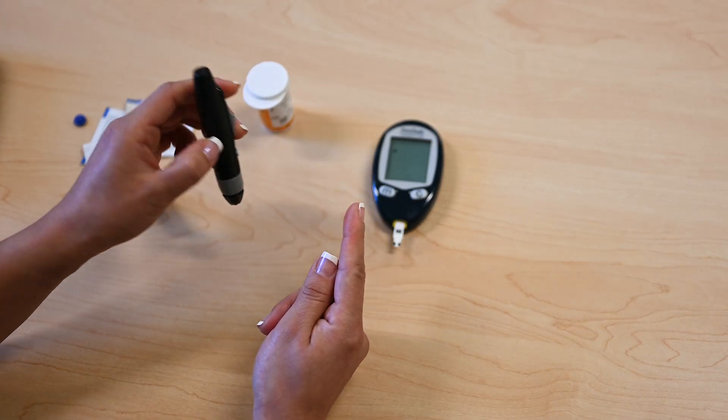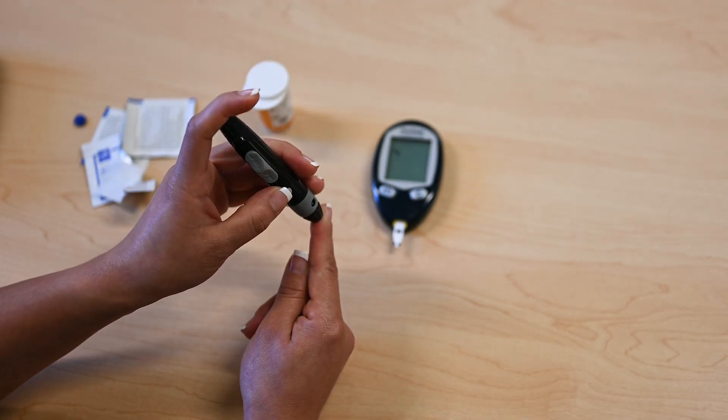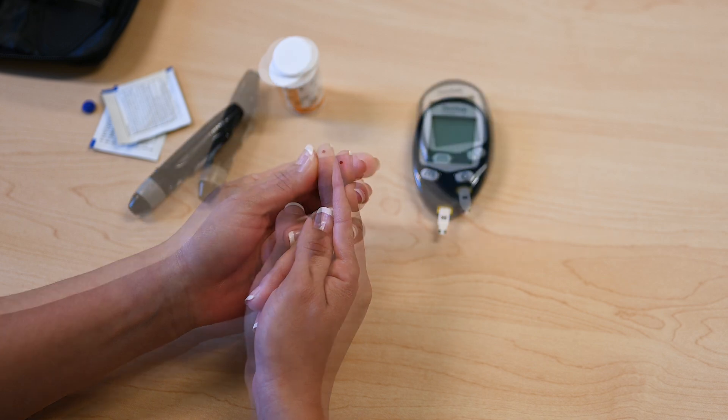Push the button on the lancing device, which releases the needle, then squeeze to allow a drop of blood for sampling.